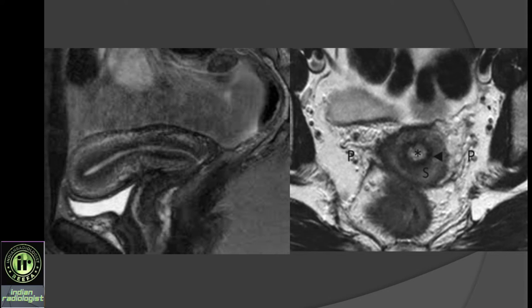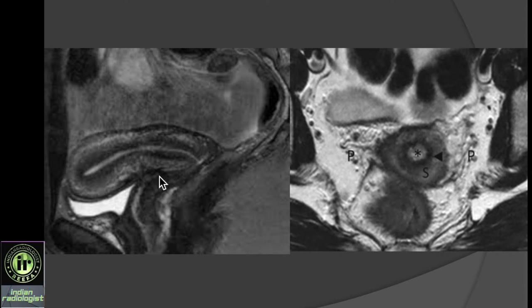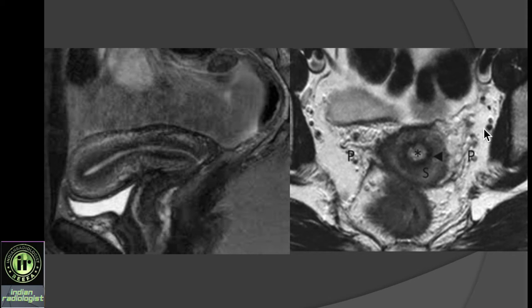Here is an example of a normal cervix on MRI. You can see the endocervical lining and the cervical stroma. In between we see the junctional zone as a low T2 signal and then the outer cervical stromal ring of low T2 signal. On axial we see a low T2 signal ring, then the cervical stroma, then the junctional zone, and the hyperintense component at the center is the endometrial lining, and then the adjacent parametrial fat. Please note that we do have some vessels in the parametrium, so when discussing tumor, don't call these as tumor extension to the parametrium, because the parametrial fat is vascular and therefore does have some internal striations.